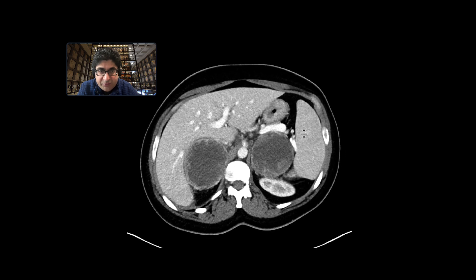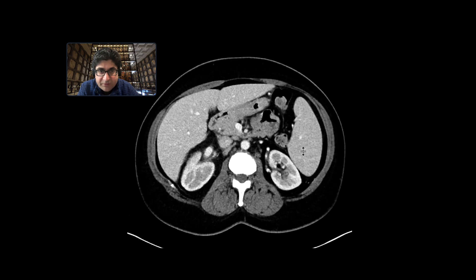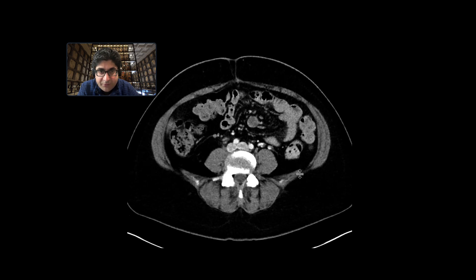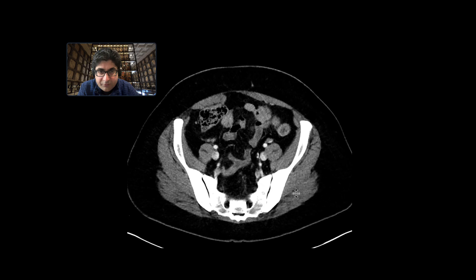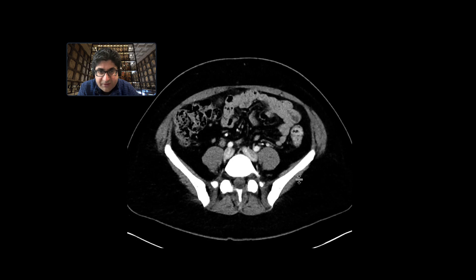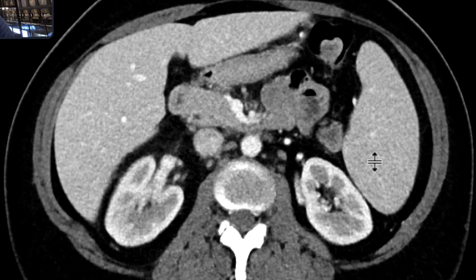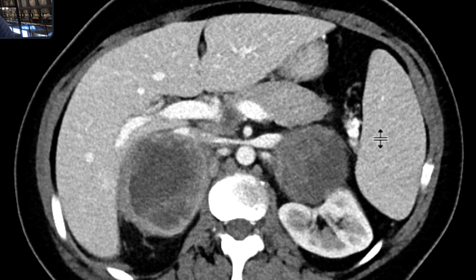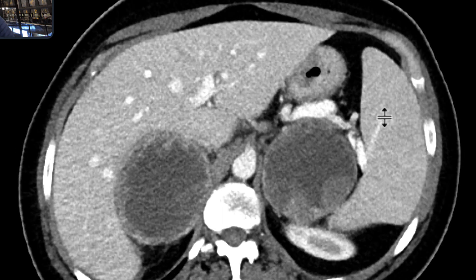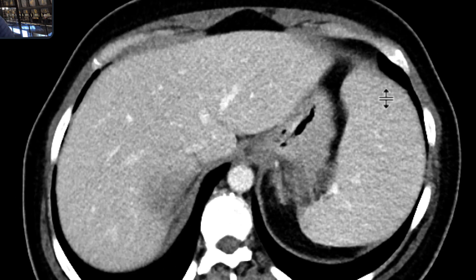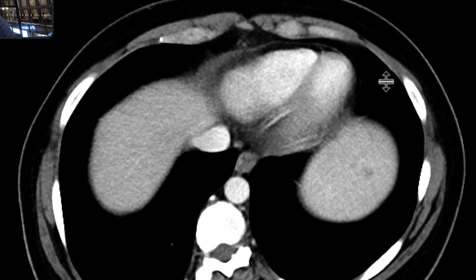As we scroll down, we can see that there are really numerous sites of disease. Melanoma is one of those primary malignancies that can really go just about anywhere, so you need to be vigilant and look at all organs, particularly carefully with melanoma.